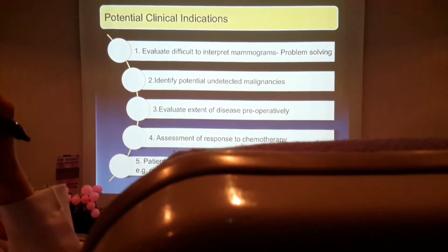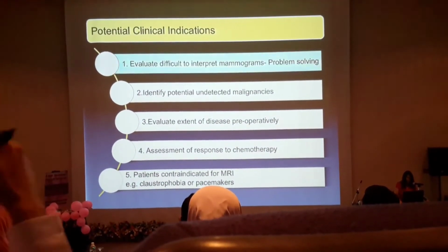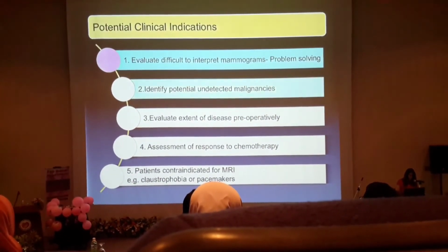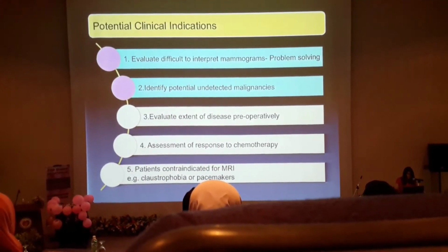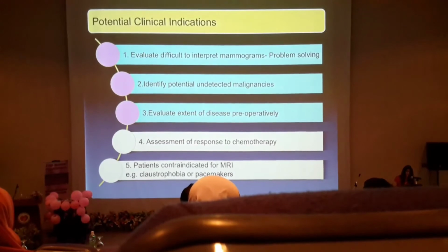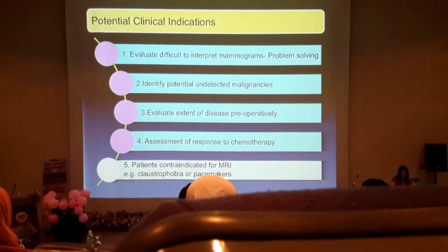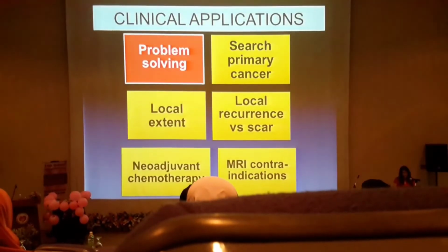So what are the indications? It is to do it for evaluation of difficult to interpret mammograms, problem solving, identifying potential undetected malignancies, evaluating the extent of disease preoperatively, which is one of the main reasons we do it, assessment of response to chemotherapy, and patients contraindicated to MRI. I'm going to go over each of them.